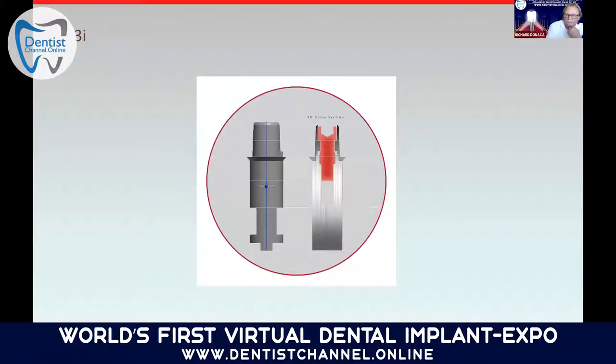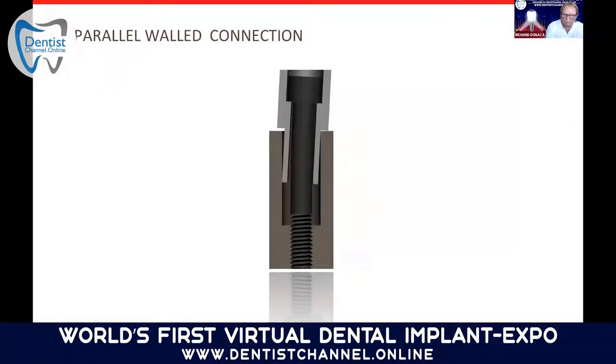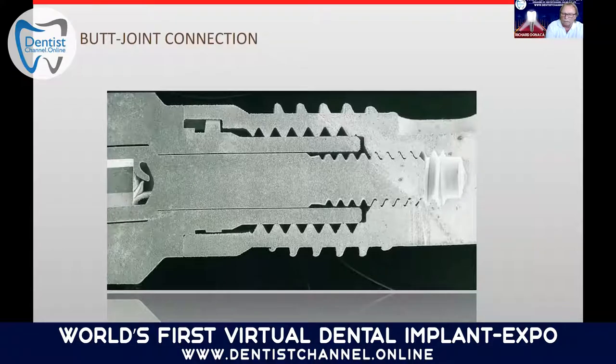If you look at the cross-section of different implant companies, you will always see some type of a gap. In all connections, except for a Morse taper, good conical connection, you will see some type of a gap or bacterial influence in the implant. Also, in a parallel wall connection, there is kind of a rocking effect of the implant connection to the abutment. So there's no real advantage to using that without a conical connection in a platform switch. Many connections today in a cross section have quite a bit of play and tolerance, so you can imagine that over time in the patient's mouth, these connections will get wider and wider and cause more and more bacterial influence and problems.